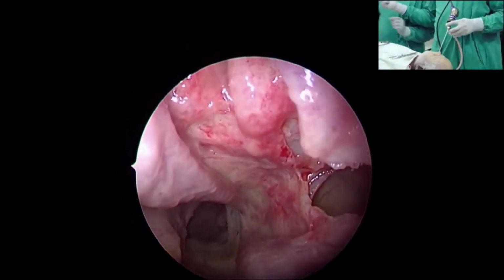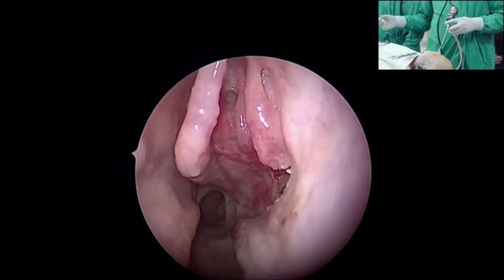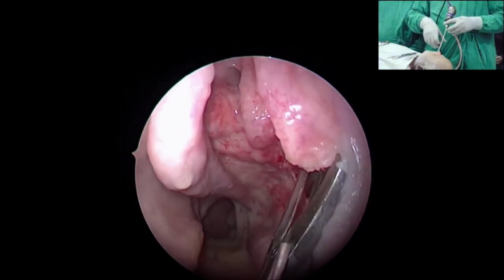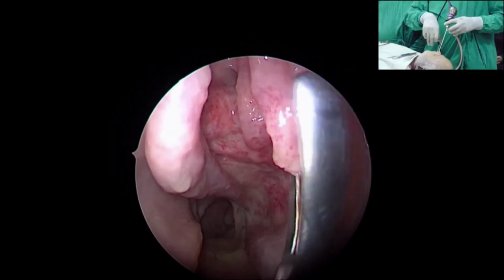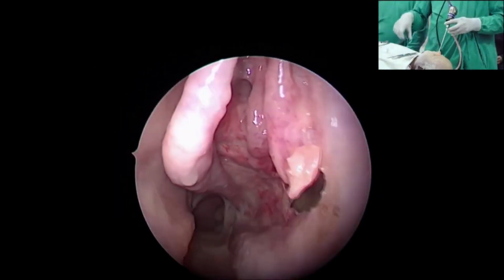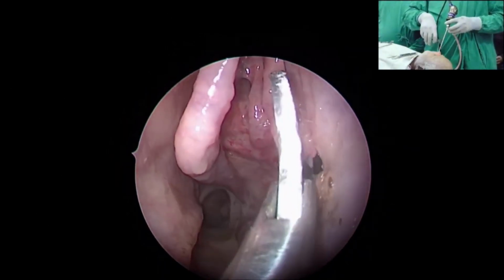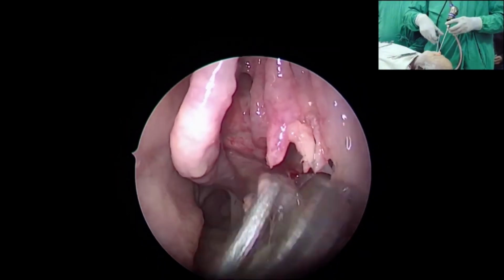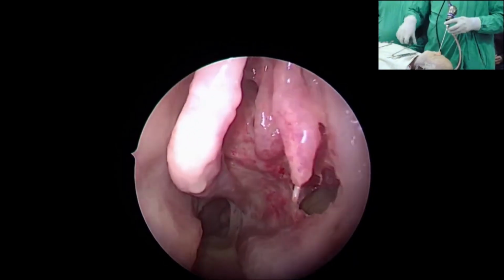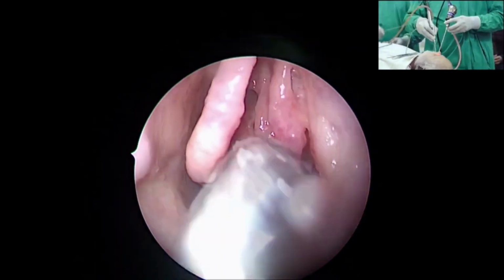What I usually do, the technique is a retrograde uncinectomy. You come from the back to the front. I usually do antegrade, like what was traditionally taught, but I don't use a sickle knife. I use a Freer elevator. You see it swing, you will know exactly the location of the lateral attachment of the uncinate process. If you put a Freer elevator into that location, and you only remove the uncinate and you go downwards, you take away the tail. The most important part of uncinectomy is to remove the tail, which Satish has shown beautifully.